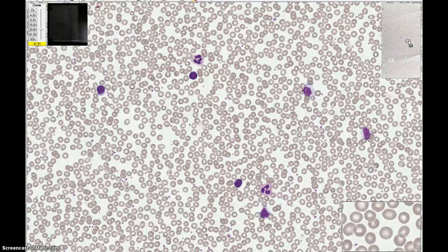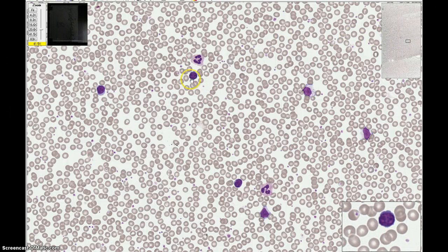We've moved to another field with another view of different cells. This cell here has a very round nucleus with very dark chromatin. There are some darker pyknotic patches in there, and there's a very small amount of blue cytoplasm. The overall cell size is not very big. This is a small lymphocyte.